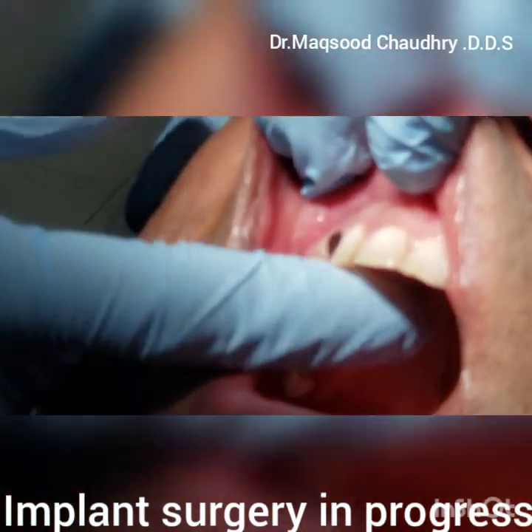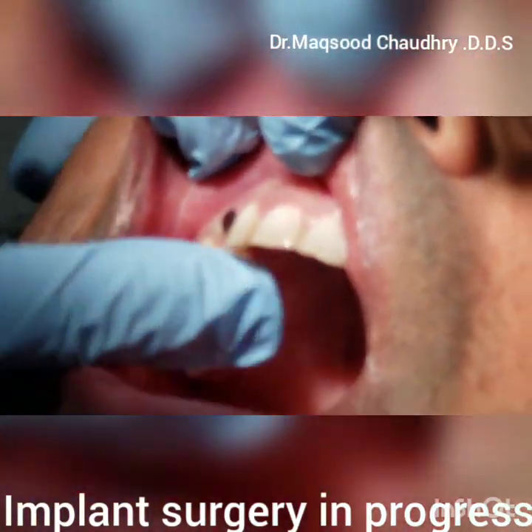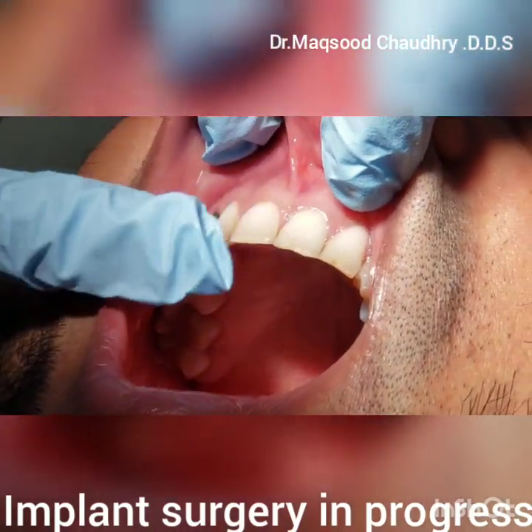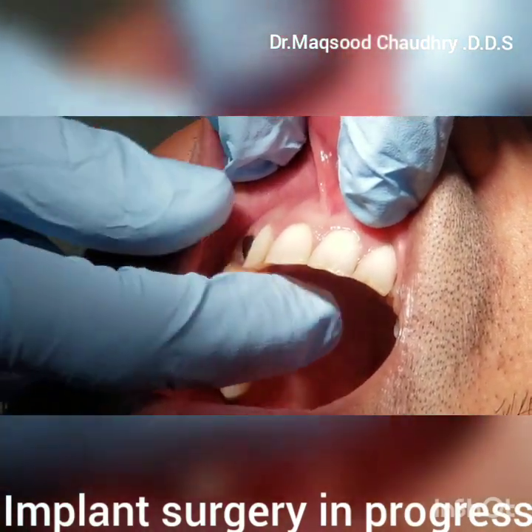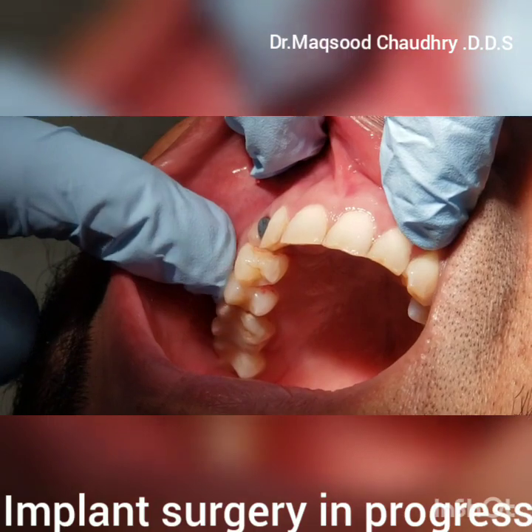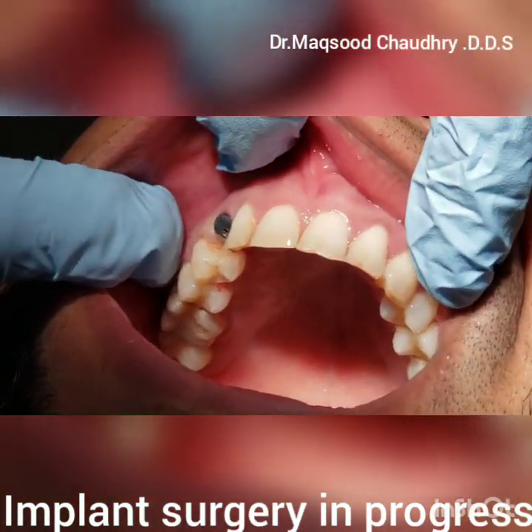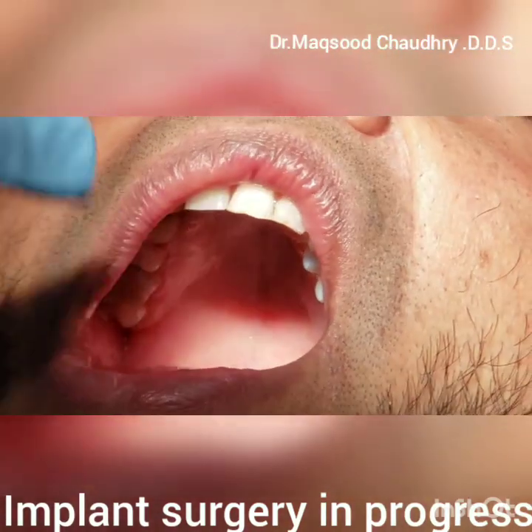No bleeding, all tissues healthy on both sides. These teeth are all lingually placed. Our implant is a little bit buccally placed as it will require a custom abutment. Otherwise it looks perfectly fine.